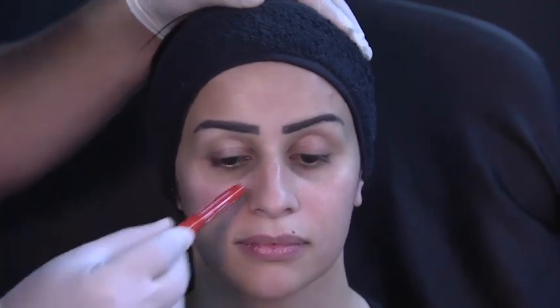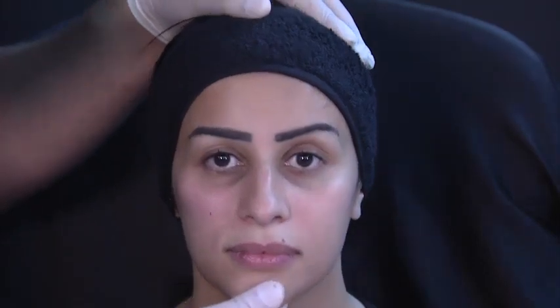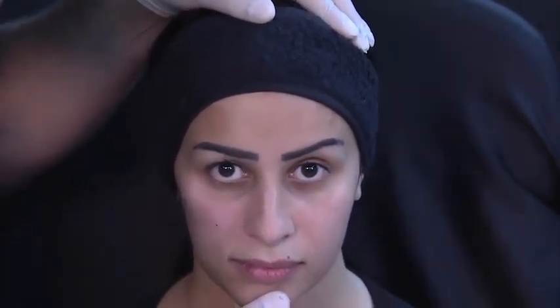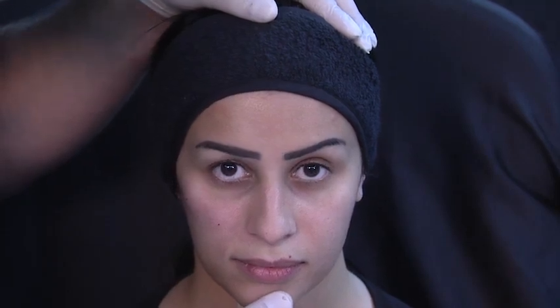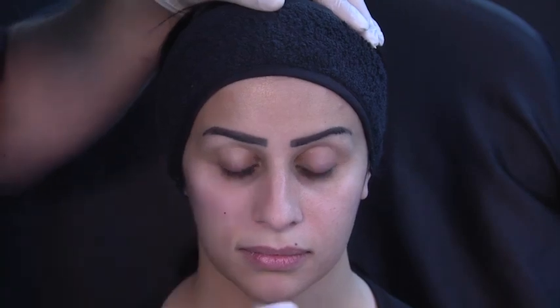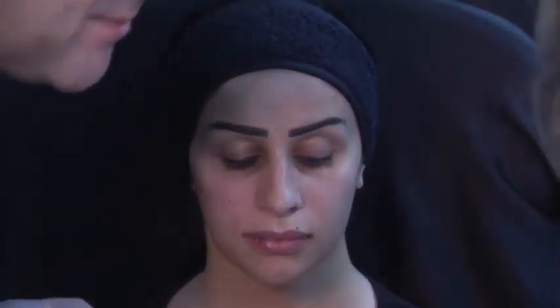Very natural. And I want to highlight again, look at the tear trough. We have not improved in this case the tear trough as much as we did before with Restylane Volume. So that means that we can create the shape, but with the indirect approach, we have a little bit less effect. This is why we're going to go for the tear trough with a product that is my personal experience and recommendation.